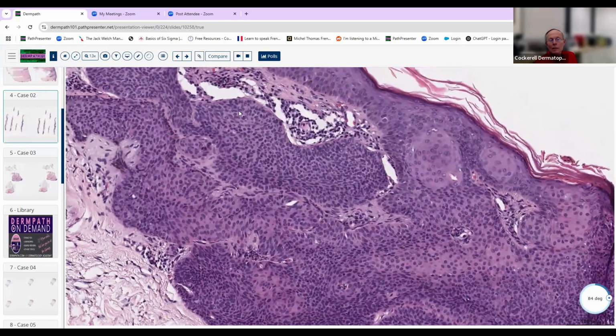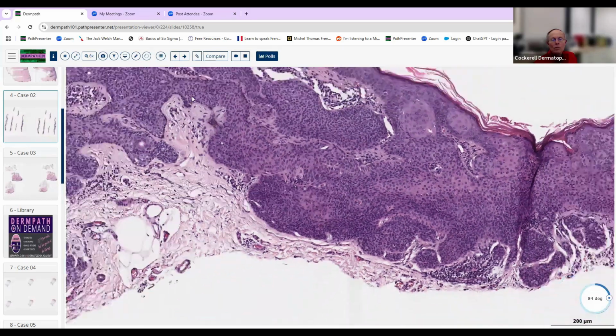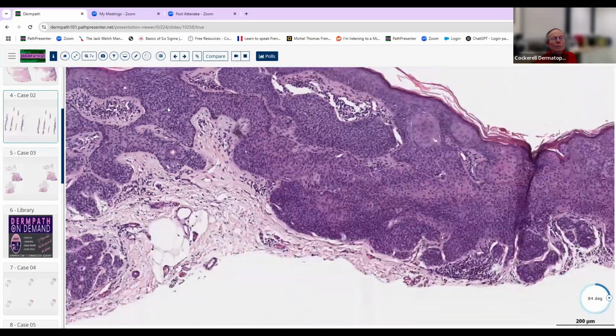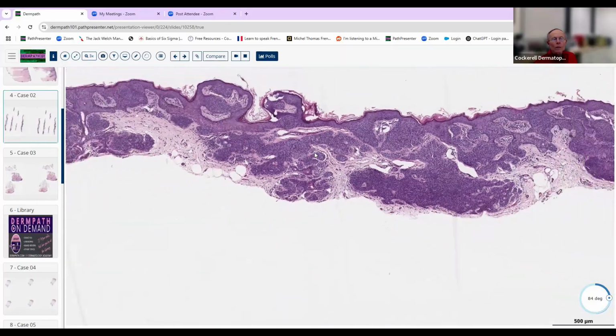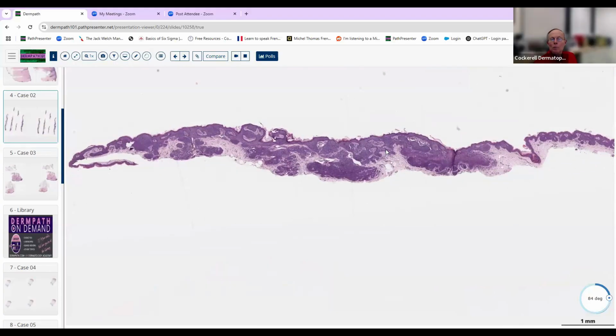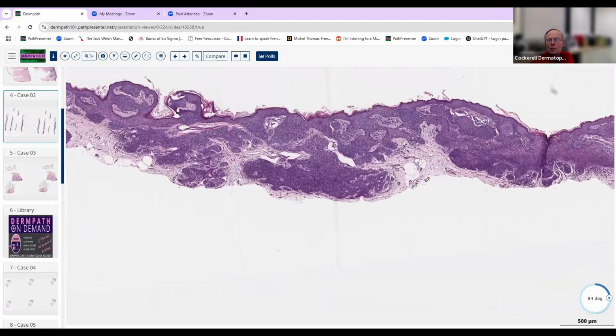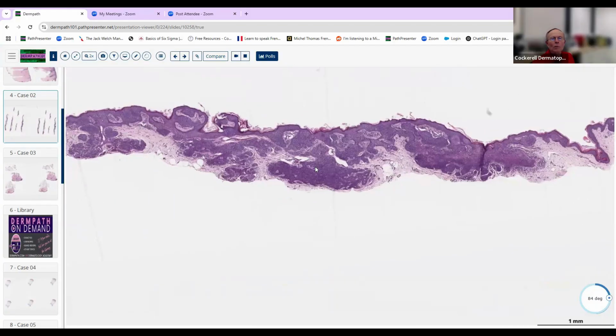So this is recapitulating primitive follicular epithelium, and some of it does look a little like the outer root sheath of the hair follicle here. So, tumor of the follicular infundibulum: totally benign, not associated with any syndrome. Just make sure you can recognize this. If they had this on a multiple choice, they might put in something like a seborrheic keratosis or superficial basal cell carcinoma. Look for the follicular differentiation, which is obviously not typical of a superficial basal cell carcinoma.